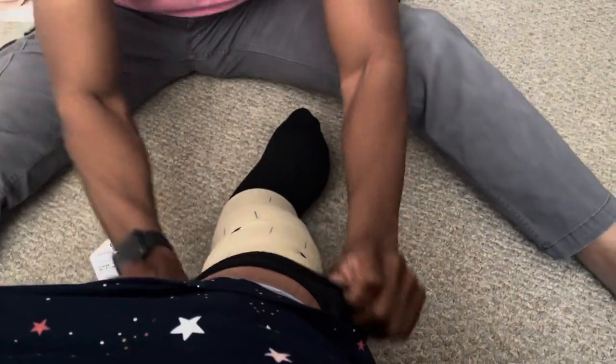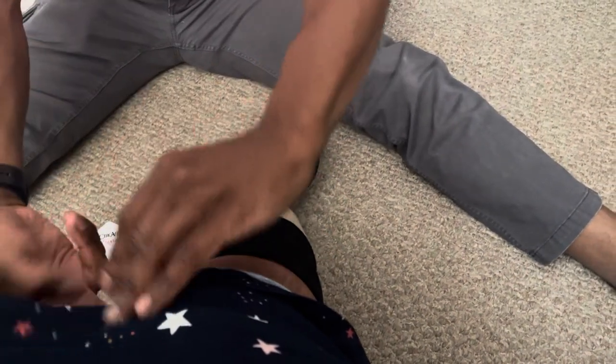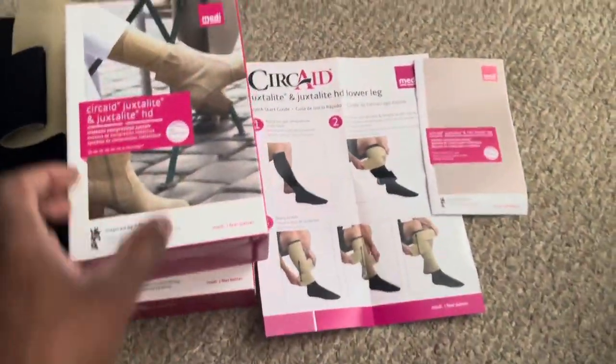After you apply everything the right way, you're going to take the top part of the sock and roll it over the top to protect the top part of the garment. It's a very lightweight garment that has long-lasting properties to it. I use this a lot in my practice, and I highly recommend it.